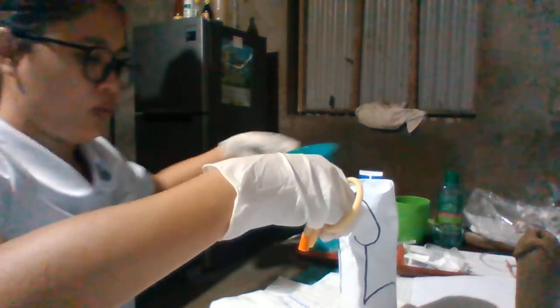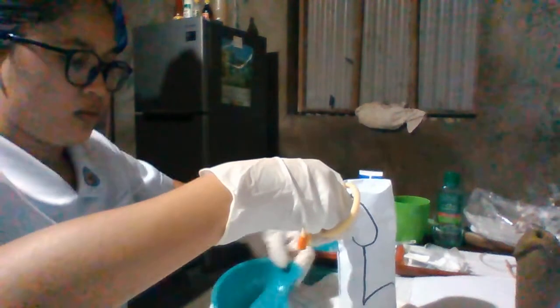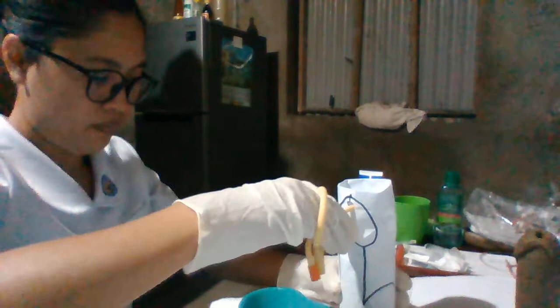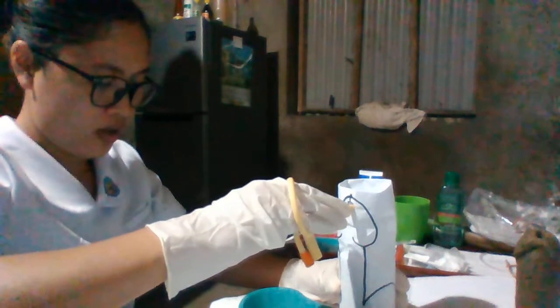and we are going to put this one here in the urine tray.